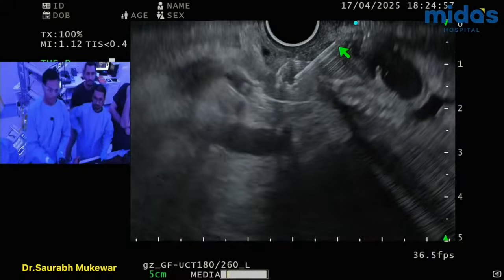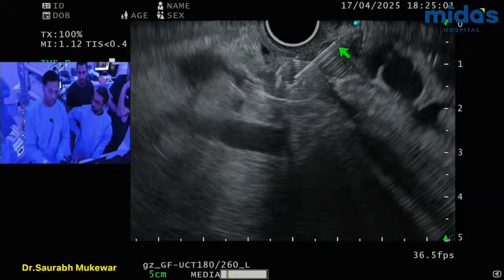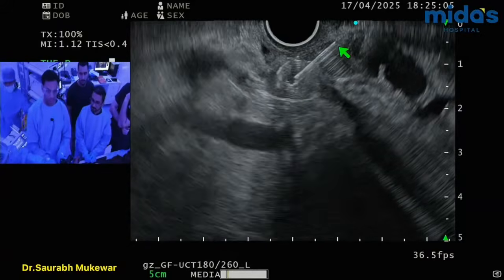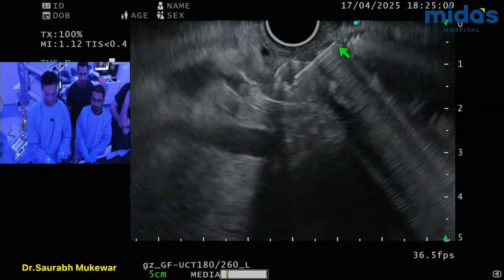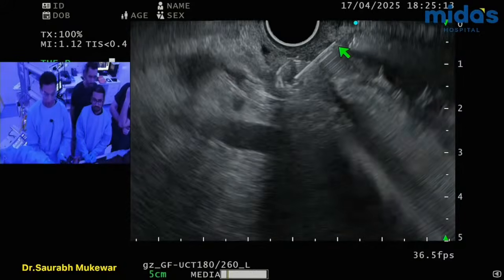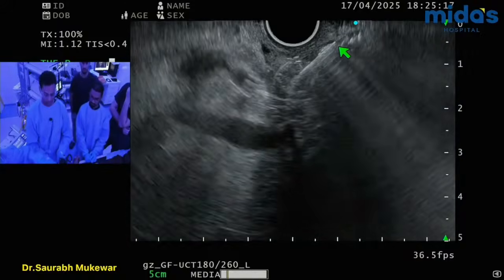So what ends up happening is that the glue is going to sit on that coil. A little bit of glue is going to go inside the varix. Injecting distilled water. Okay. Yep. So you have to save it, right? Okay. Injecting glue. Beautiful. Very good. Good job. Injecting distilled water.